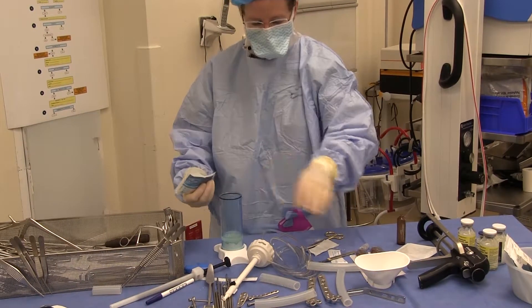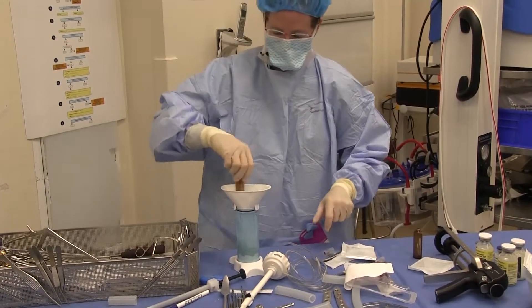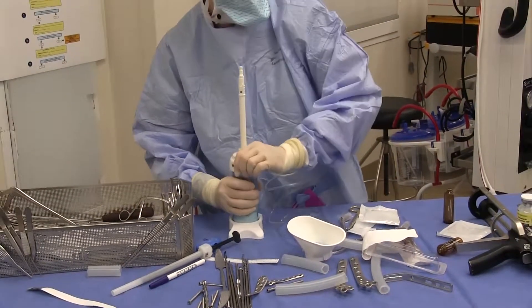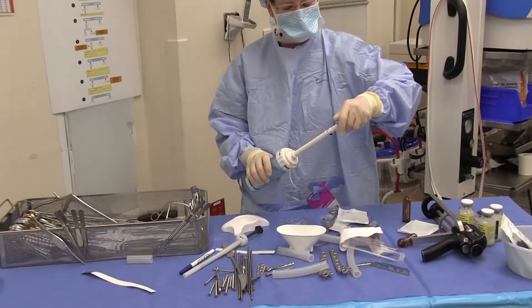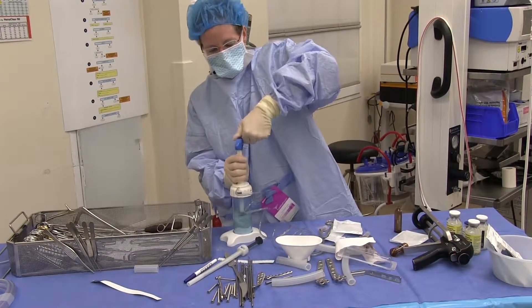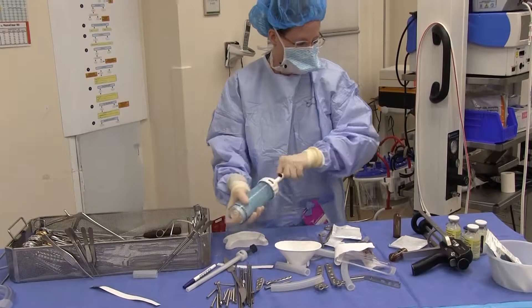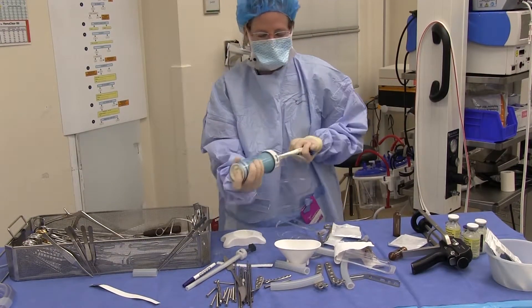Since I'm coating multiple plates, we'll use two bags. For demonstration purposes, I did not add my antibiotics into this batch of cement, so I don't waste them. But for all intents and purposes, if you use two bags, use at least three to three-and-a-half monomers if you're going to add the 3.6 grams of tobramycin and a gram of vancomycin per bag.